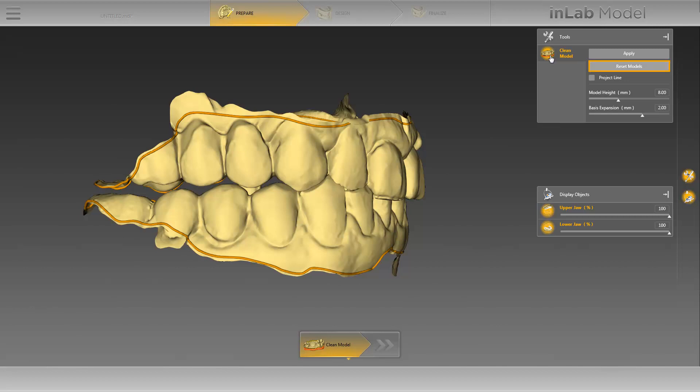By clicking on Reset Models, you can reset the newly defined cut line. By activating the Project Line option, the line you have defined will be projected on the opposite jaw. Using the Model Height slide controller, you can adjust the height of the model base. It should be noted here that for an implant case, the model height should be defined according to the height of the implant analogs.